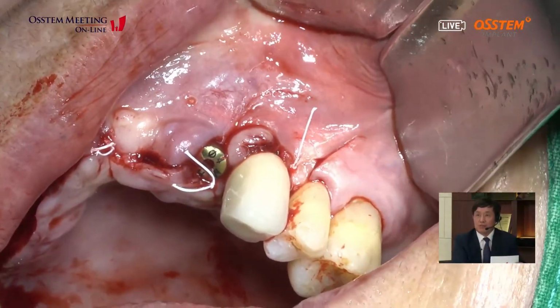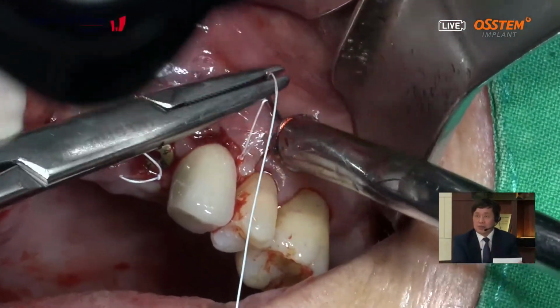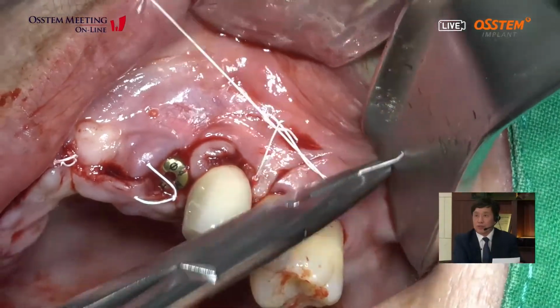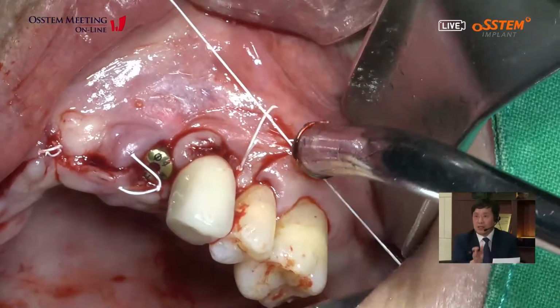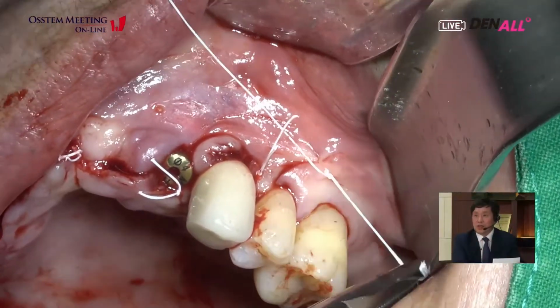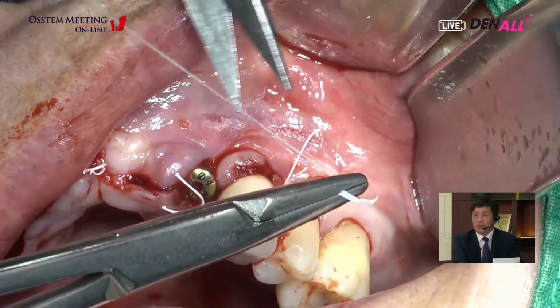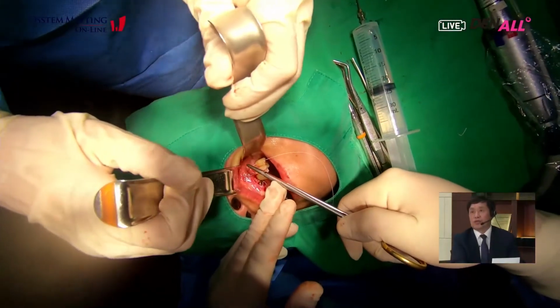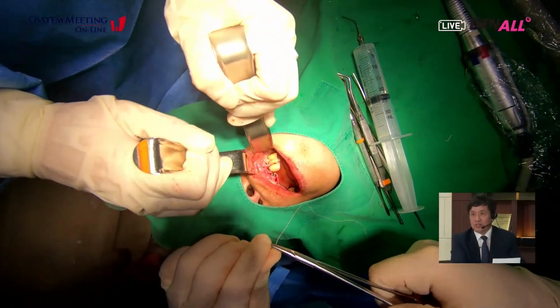Tension-free suture is very important in GBR, and especially Dr. Kim already used abundant bone graft materials for the GBR. In such a case, tension-free flap approximation is very important to prevent exposure of the flap and wound dehiscence.